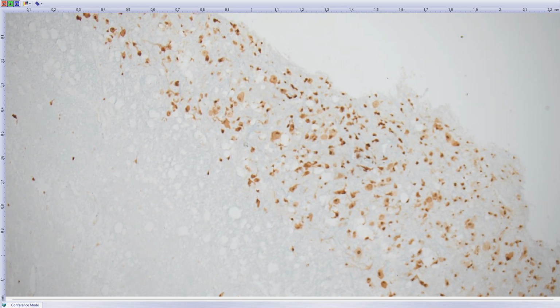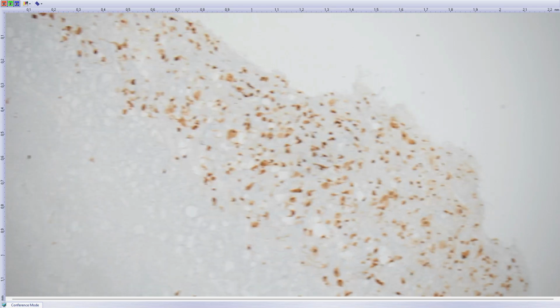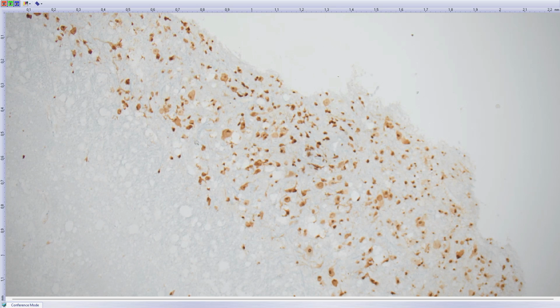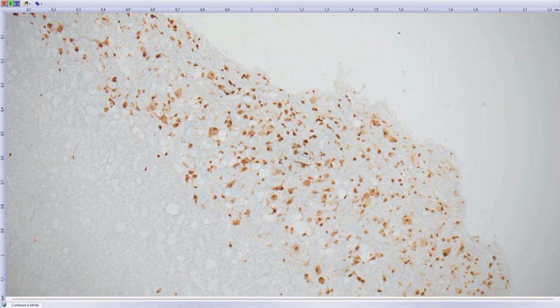This was formerly thought to be a hamartomatous lesion, but nowadays probably should be considered a benign neoplastic lesion. In this case, we have performed molecular genetics, and it came back with a PTEN gene mutation with allelic frequency of about 50%, so it's quite suggestive of germline.